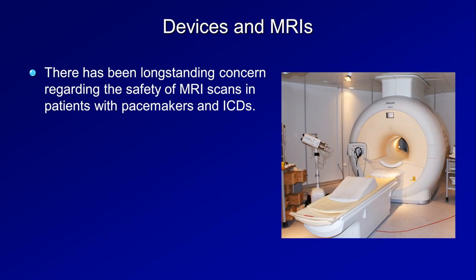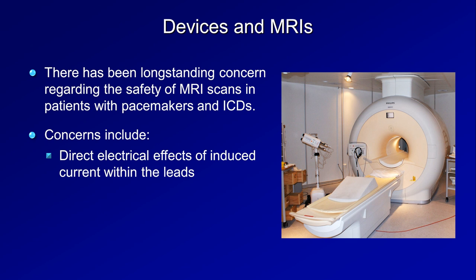There has been long-standing concern regarding the safety of MRI scanners in patients with pacemakers and ICDs. After all, MRI scanners contain extremely powerful magnets, and magnets can induce electric currents. So you can imagine one of the concerns is that the MRI scanner will have direct electrical effects from induced current within the leads. This can lead to inappropriate inhibition or triggering of the device, such as oversensing, leading to a failure to pace, the triggering of tachyarrhythmias, and potentially even inappropriate ICD shocks.